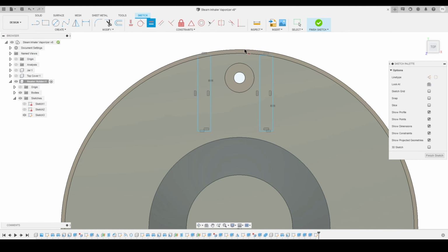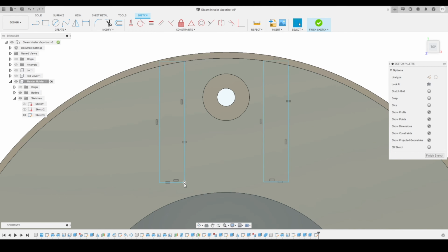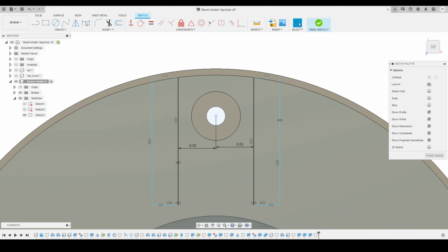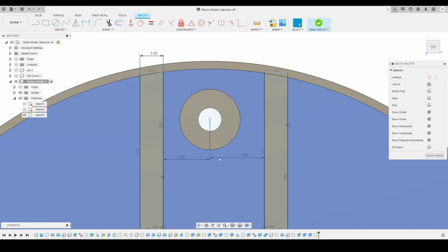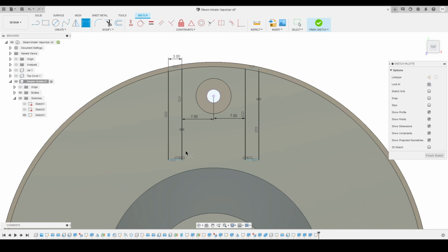I will make sure that they are positioned correctly, and I will also make sure that these two are on the same horizontal position. And now I will define the distance of this rectangle from the center of the circle. So this one I just want to keep 6 millimeters. We can modify it later also if it is not good. So for now we are keeping it 6 millimeter, and the width of this rectangle we are going to keep 3 millimeter. Since both the rectangles are equal, it's automatically getting adjusted. Now I will change this to 7 millimeter because 6 millimeter was a little closer. Now I will define the total length of this rectangle as 20 millimeter.